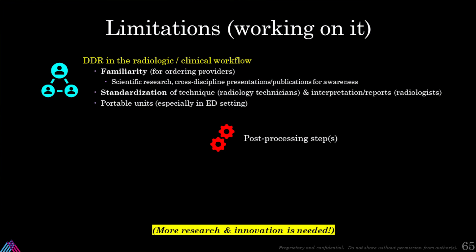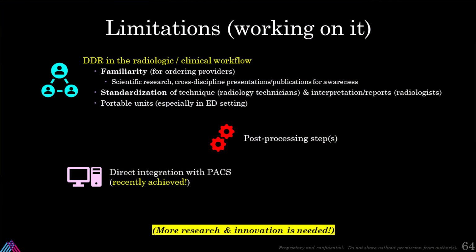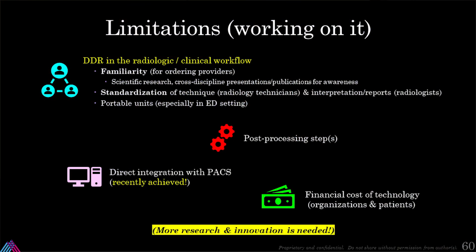Next is the post-processing steps. Those need to be, again, researched and analyzed. Which ways can we enhance DDR to get the best images, and which ways can we get the best diagnoses? The next is direct integration with PACS, which we've recently achieved, but which images would be most useful for radiologists or even pulmonologists, kind of sending back and forth. And lastly, the financial cost of the technology to the organizations and patients.